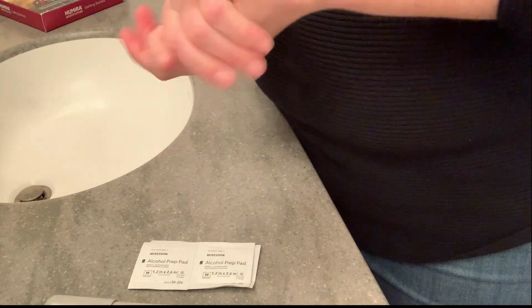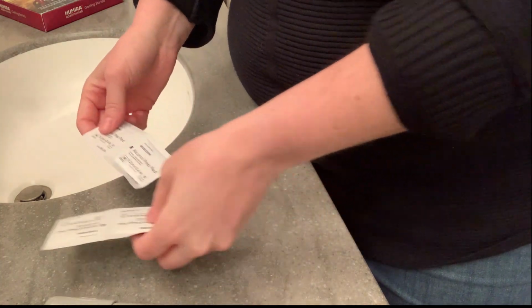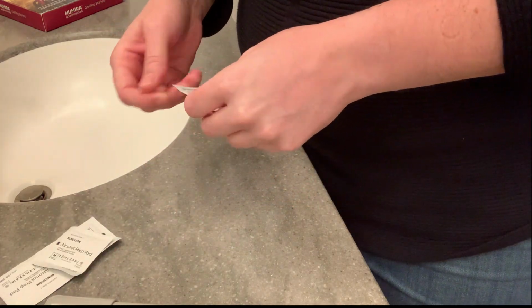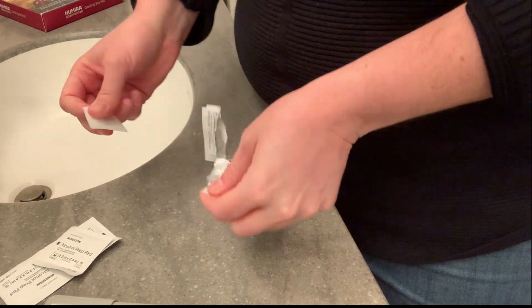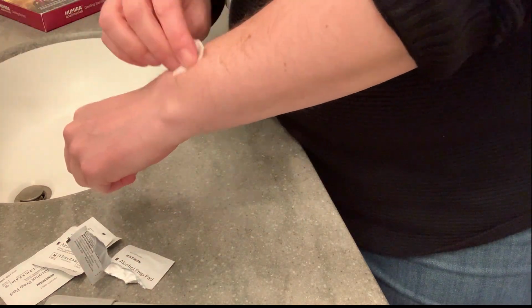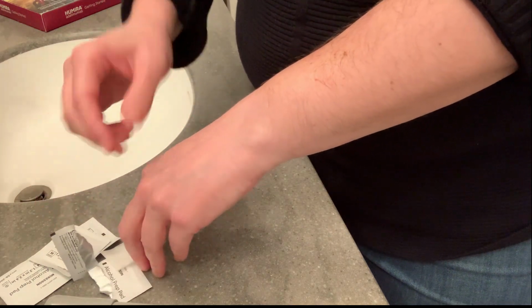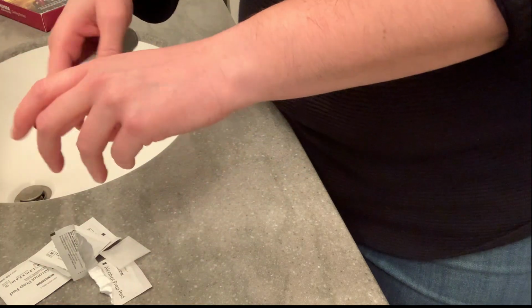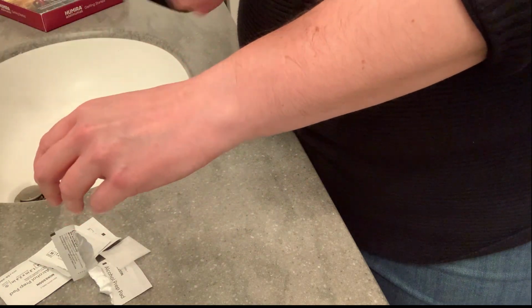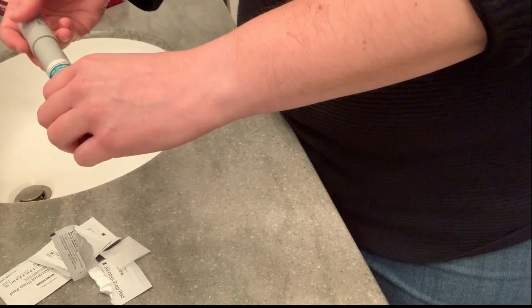Now, I can't really inject my abdomen or my thigh right now, so I'll use my arms, so it's not exactly perfect technique, but it'll do for now. So let's say we use my forearm, so you'll want to wash the area. If you have a rash, don't inject through the rash or mole. Like, you want to have just normal skin. So you can have it just dry up a little bit so it doesn't sting as much.